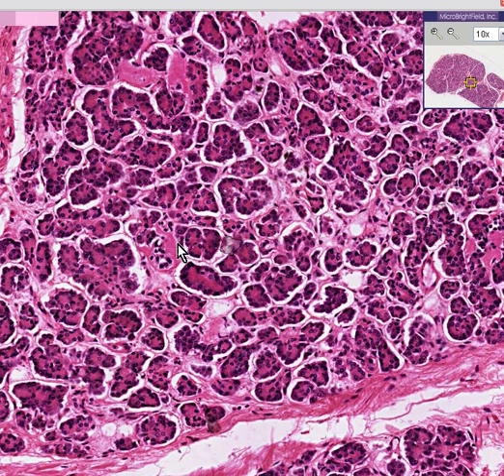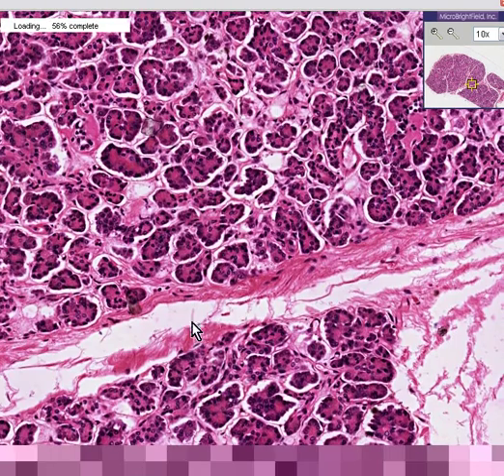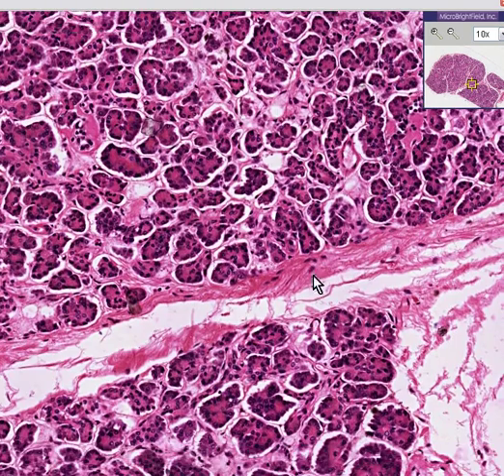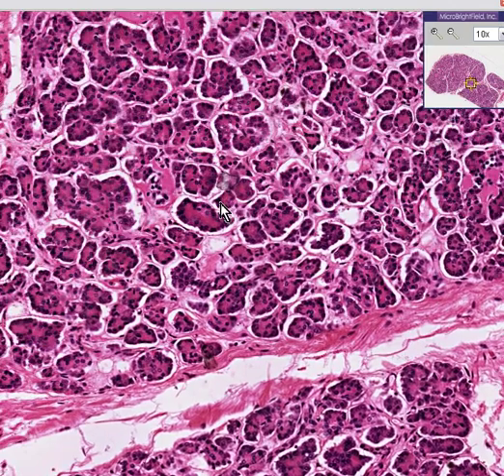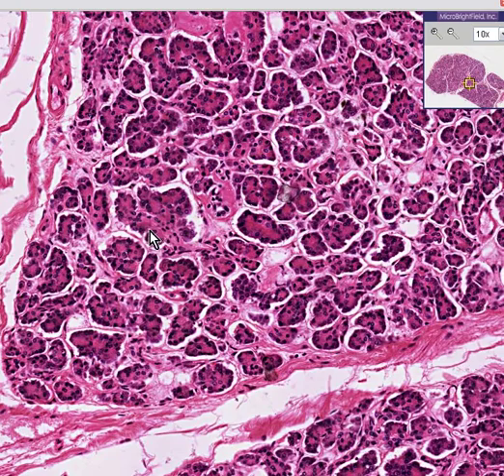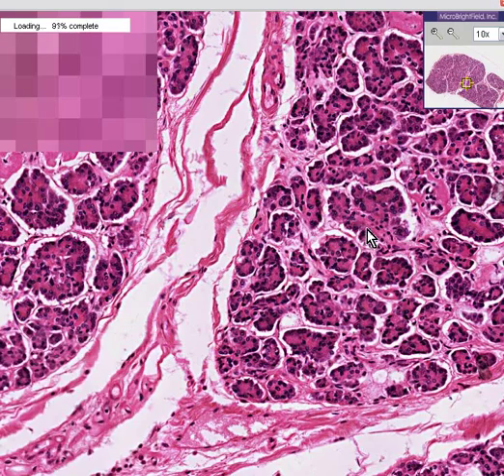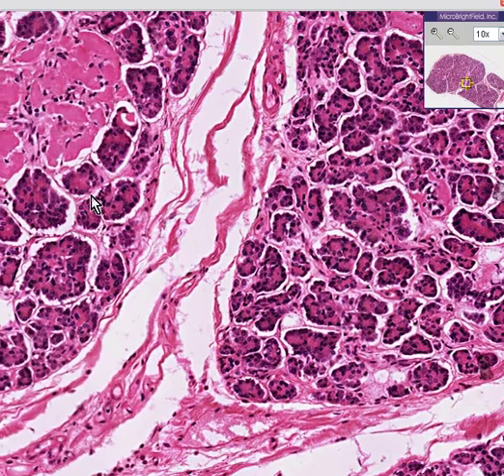Here are the acini. This whole thing could be considered a lobule, and here's some connective tissue between the lobules. As you know, the pancreas is a classical exocrine gland, but it is also an endocrine gland.